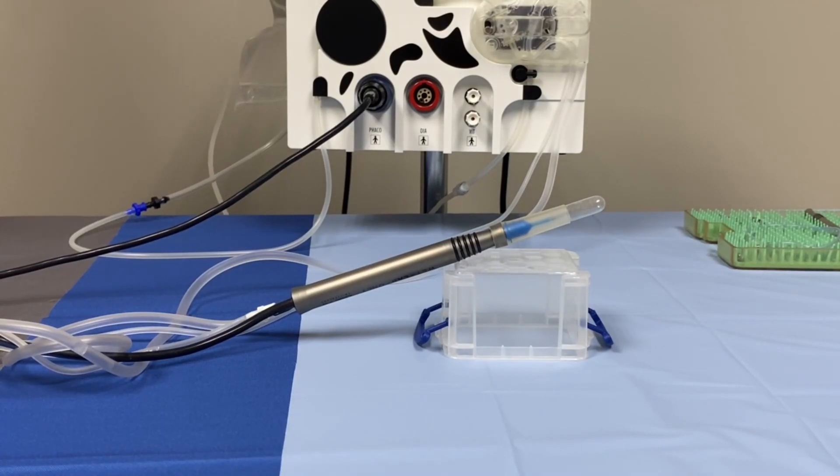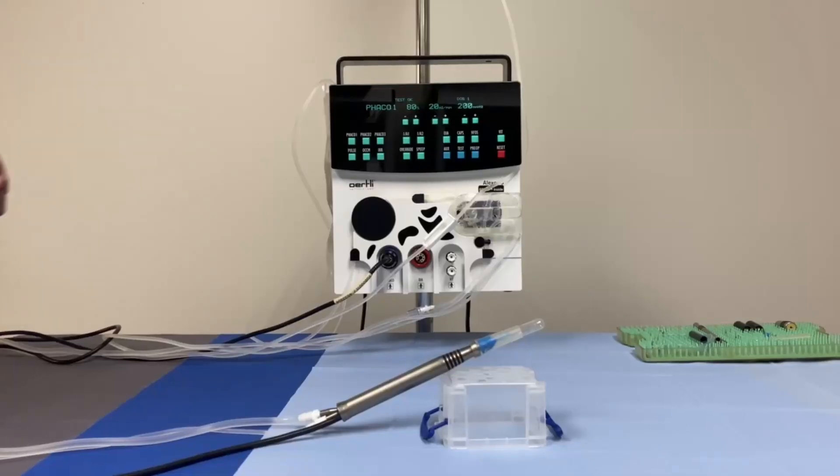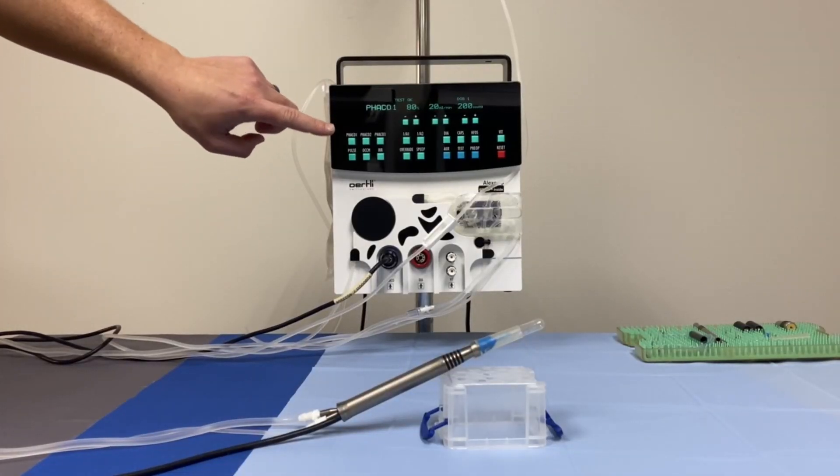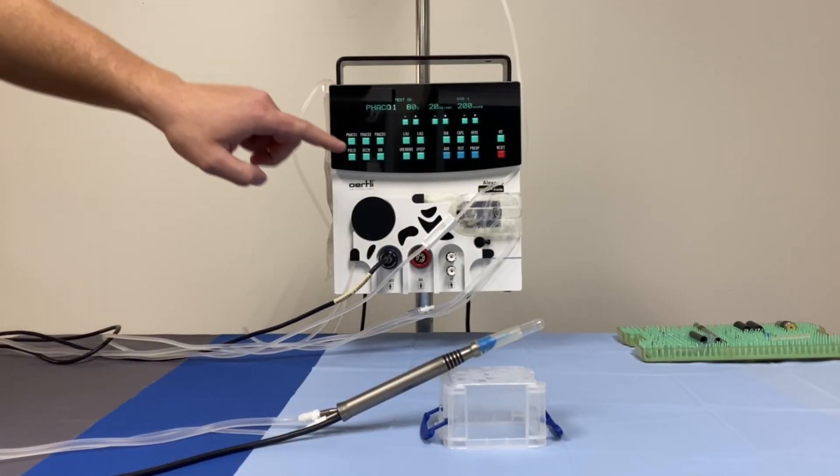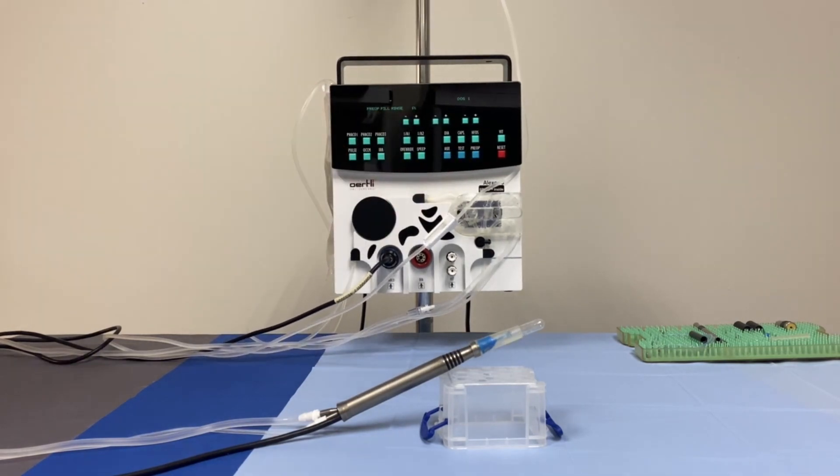Place the handpiece at a 45-degree angle to ensure optimal priming. Press the pre-op button to start the priming cycle. Ensure that a FACO function has been selected in order for the pre-op to test the system's FACO power. The machine automatically fills the test chamber. The FACO tip must be completely submerged in fluid. Allow the machine to run through the cycle until it displays test OK.